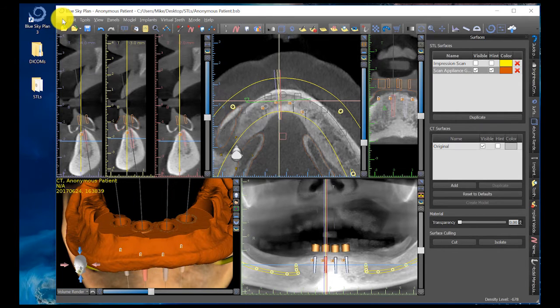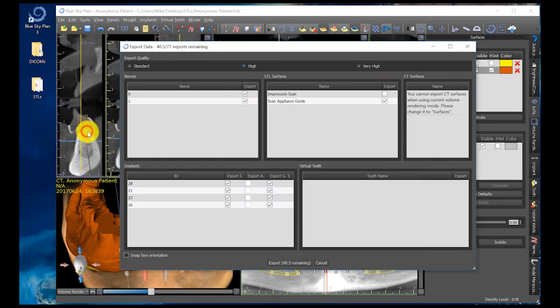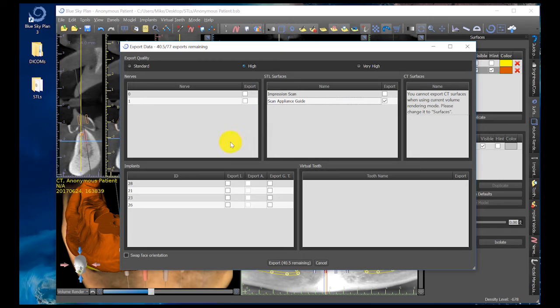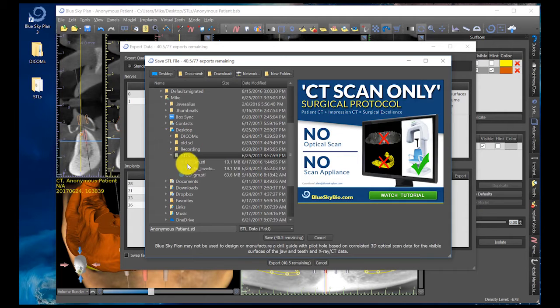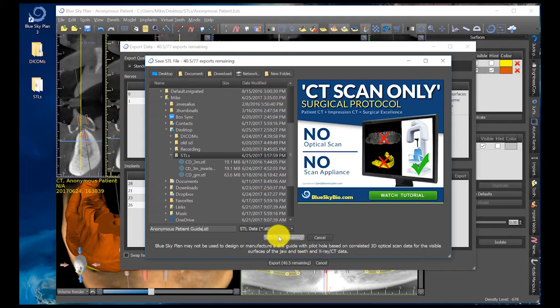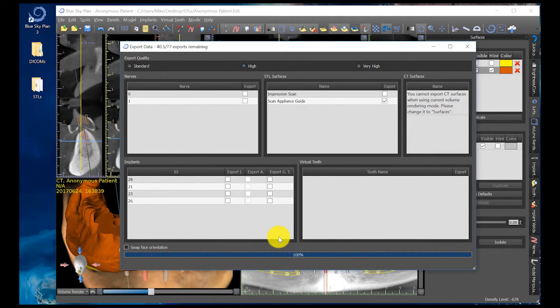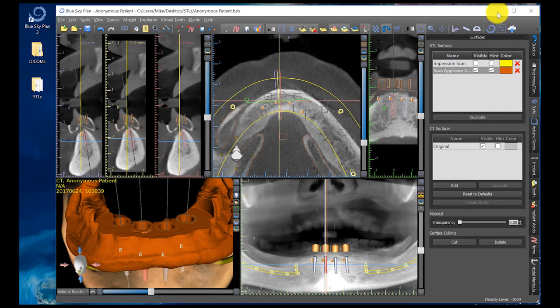This surgical guide will guide my drill stops in my locator overdenture implant system surgical kit — and this is a successfully designed surgical guide. To export it, I click on File, Export Data. I turn off everything by clicking the boxes and the only thing I want selected is the check on the Scan Appliance Guide. I click Export, save it under my preferred folder — Desktop STLs — and call it 'anonymous patient guide.' Click Save, and now I've just exported my surgical guide.